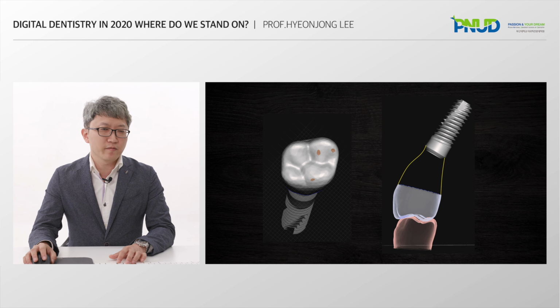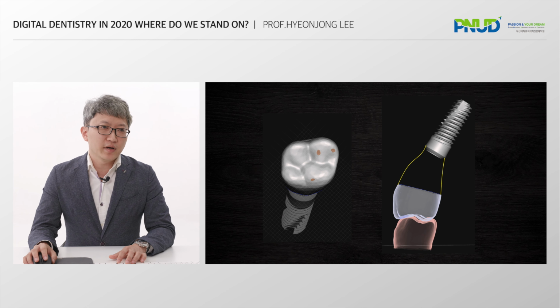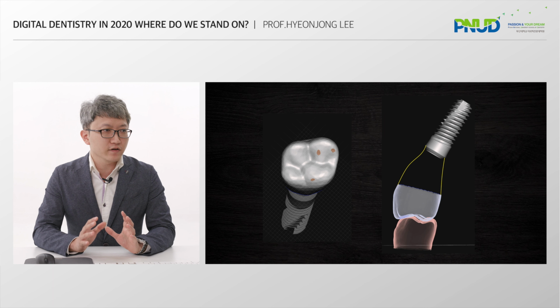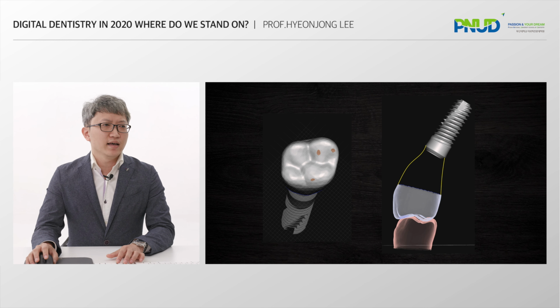In this case, I performed automated vector analysis. This was the first version of the occlusal design, and I think there are only 3 points of occlusal contact.